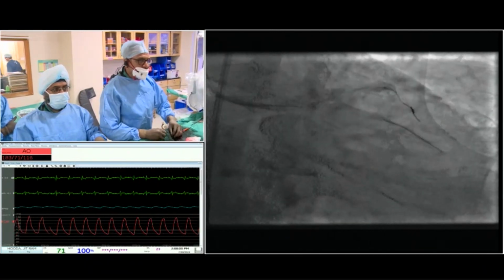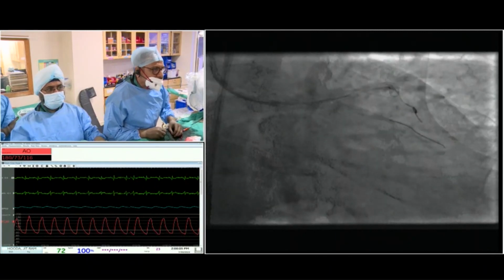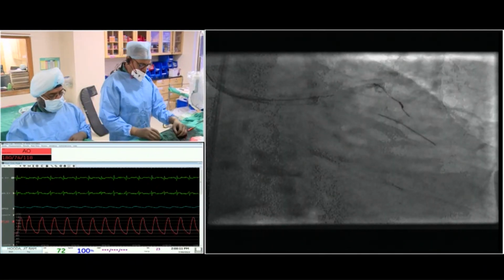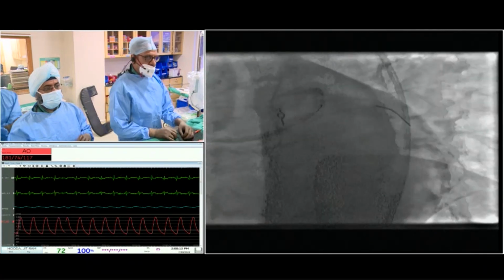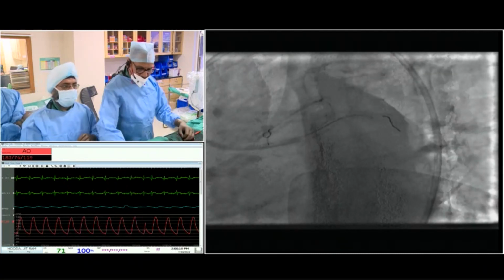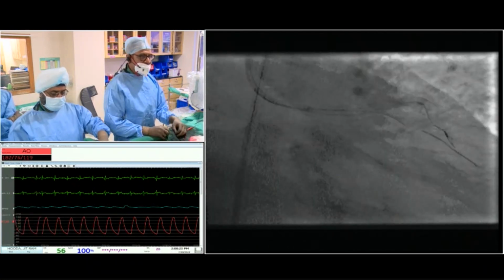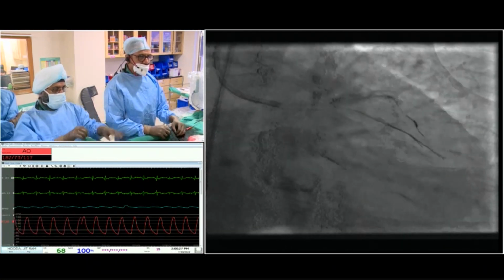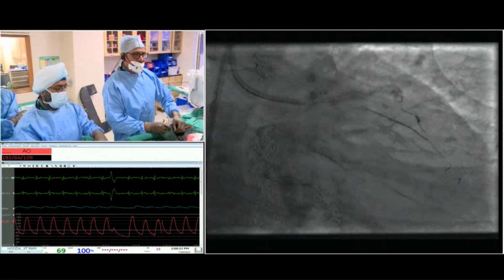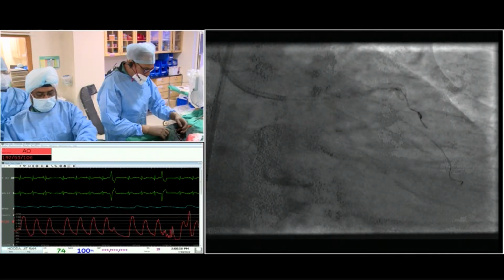Yeah. Oh, sorry. Yeah, go to spider further. It came out. Yeah. But the crossing, the rewiring is pretty easy here. Go to spider. Go to caudal, RAO caudal. Any suggestions in the middle of this case? No, you're doing very nicely. Now I'll remove the trapped wire here smoothly. The trapped wire is removed because it gave me guidance as to where to cross, recross.